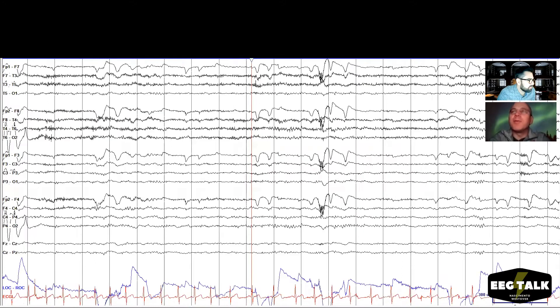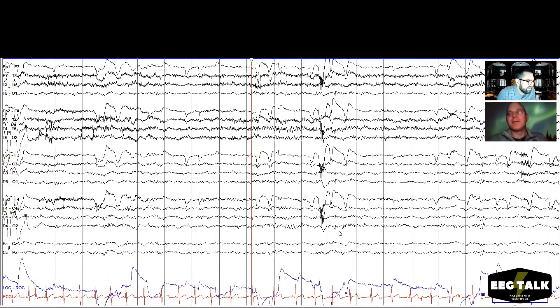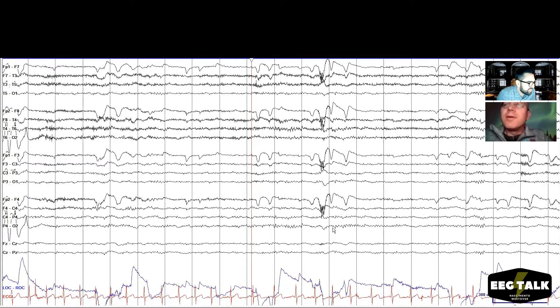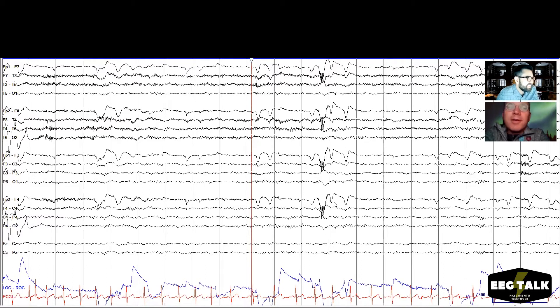So we have a 12-year-old. Looks like this kid's awake — I see him blinking a lot. And they have a pretty nice posterior dominant rhythm (PDR) in the back of the head. Yeah, it's alpha rhythm. I agree. Let's take a look — guessing it's about 11 Hz, but I haven't counted. Eight, nine, ten, eleven. Yeah, nice. Pattern recognition is still working.